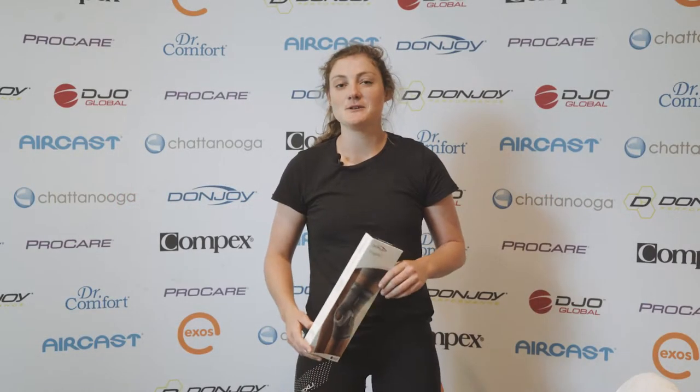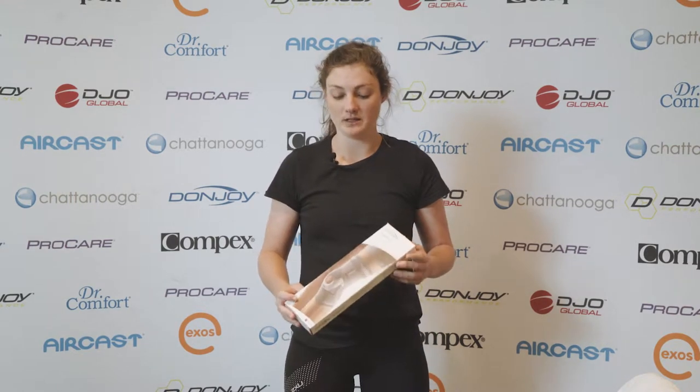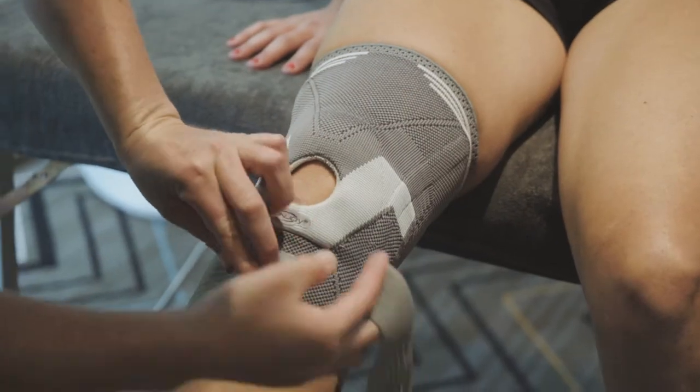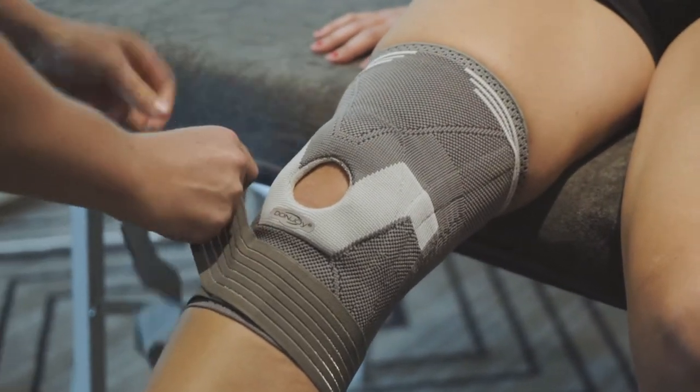I'm Emily from Bay Active Physio. I'm a physiotherapist there and at Bay Active we use the Donjoy strapping knee brace. We use this for a range of conditions where you need to improve knee stability, whether that be patellar issues, meniscus issues, or ligament issues.